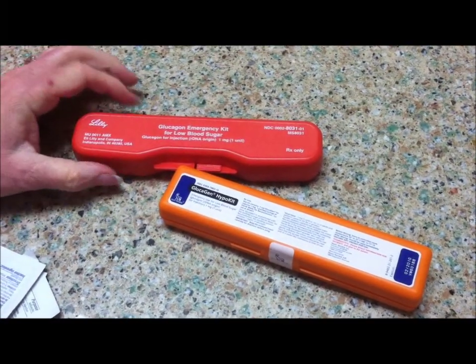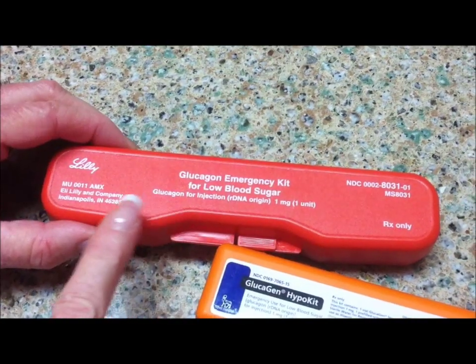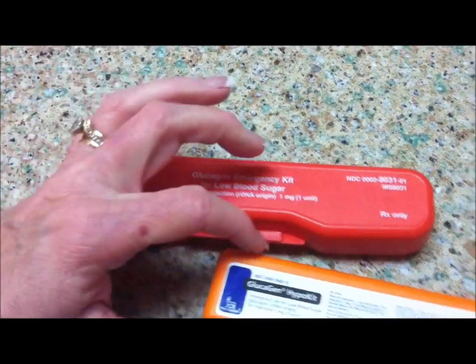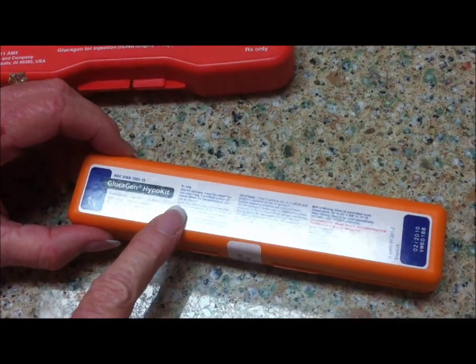There are two companies that make the glucagon emergency kit. Lilly makes a glucagon emergency kit that comes in a red container, and Novo Nordisk makes the glucagon hypo kit that comes in an orange container.